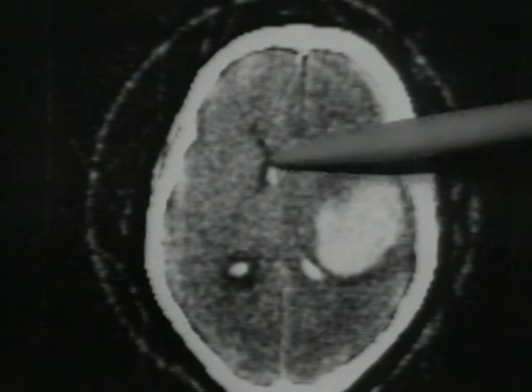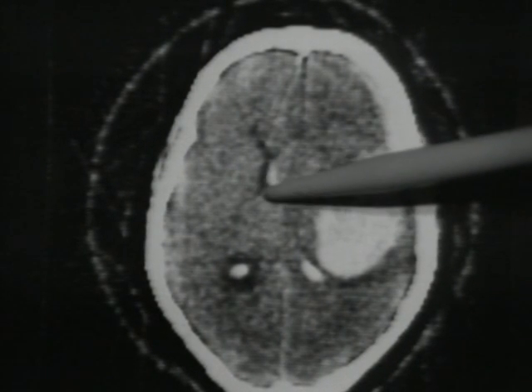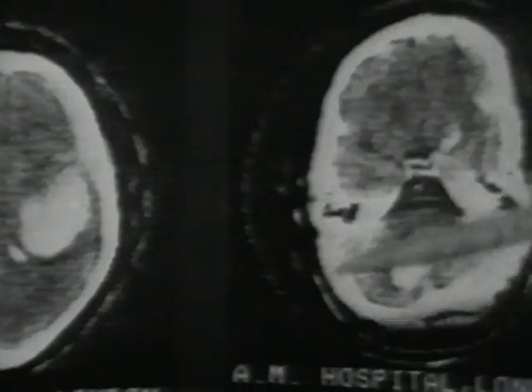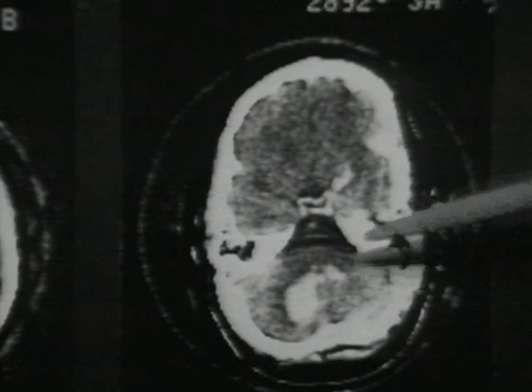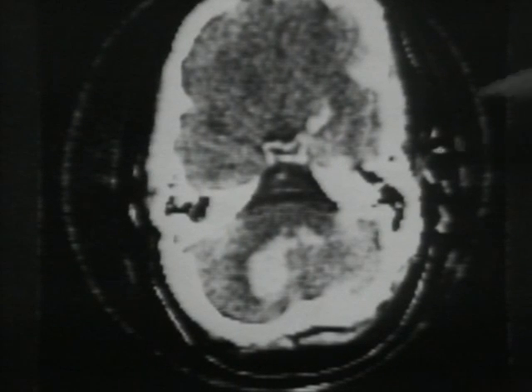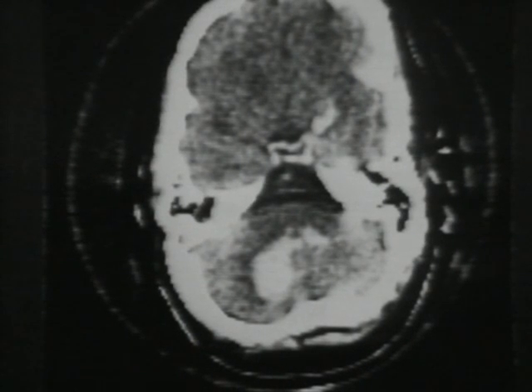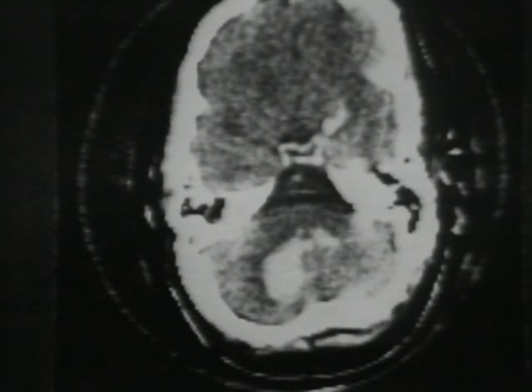You can also see a thin strip of clotted blood lying subependymally along the lateral wall of the compressed right lateral ventricle. Here is another patient with a primary hemorrhage, but this time in the vermis of the cerebellum. Now, this is an extremely dangerous type of hemorrhage as far as life is concerned. And the sooner it's diagnosed and the compression relieved, the better for the patient. Here you can see that the EMI scan has provided us with all the information we require. We can, in fact, perform an operation and remove the clot merely on this information.